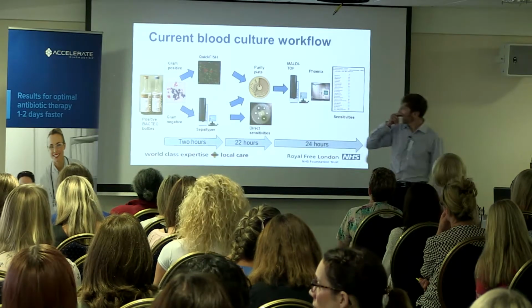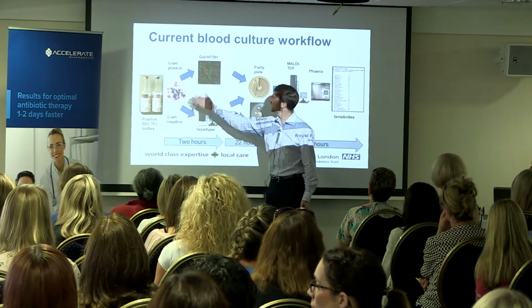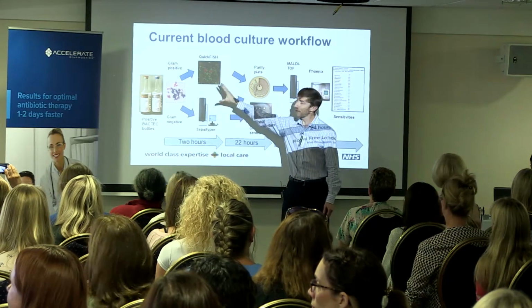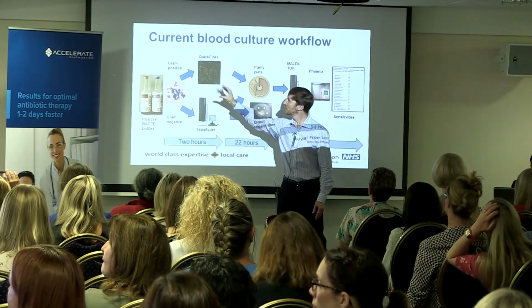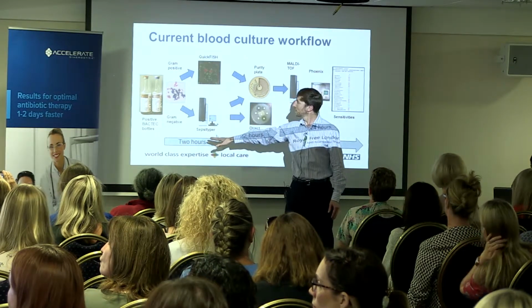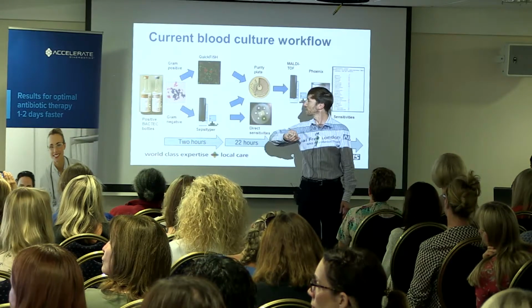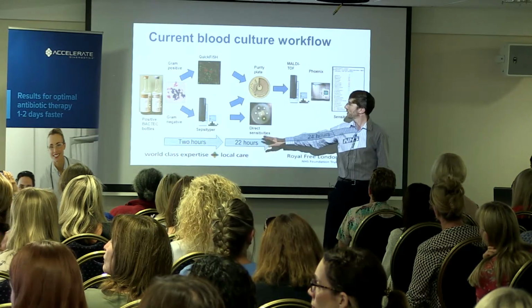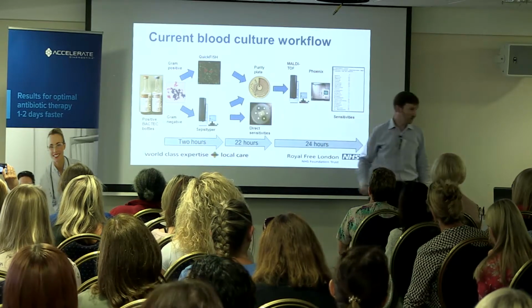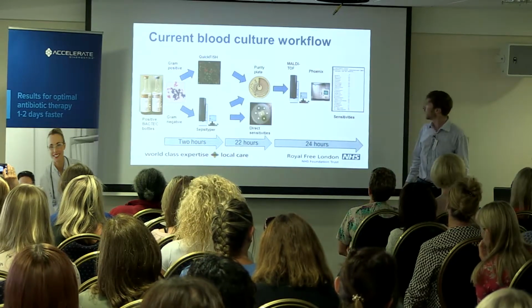And so it looks something like this. We have the gram stain here. QuickFISH, which I'll show you, takes about 20 minutes, and so we phone that out with the gram stain to the clinical teams. When we have a positive result from the QuickFISH, we can use the Sepsityper for the gram negatives that aren't on the QuickFISH panel. We have some direct sensitivities after about 24 hours, and then another 24 hours for the final sensitivity result.